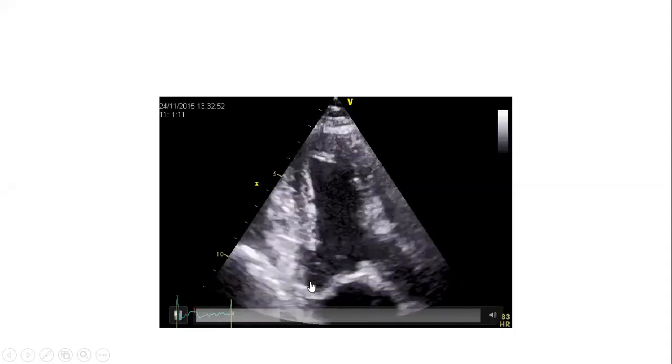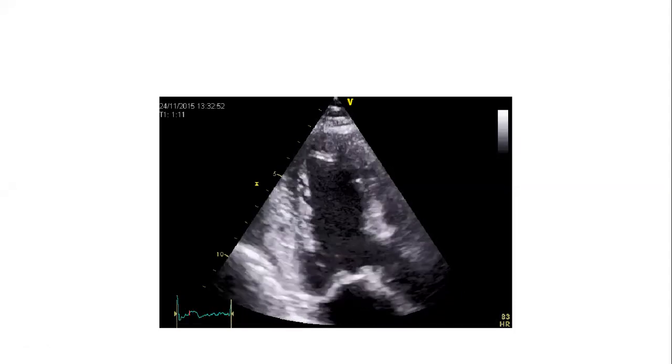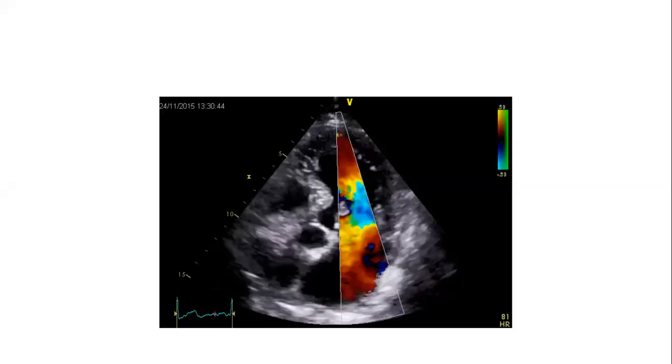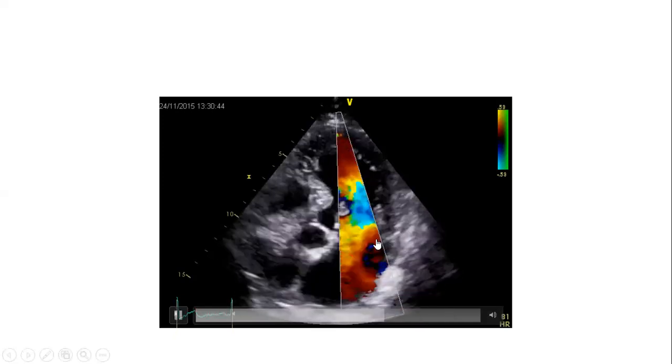And when we have this, both lateral wall and inferior wall have got a papillary muscle, and those patients will have significant ischemia leading to mitral regurgitation. Now look, they have got a significant ischemia. Can you see that mitral regurgitation? Yes, sir. Mitral regurgitation.